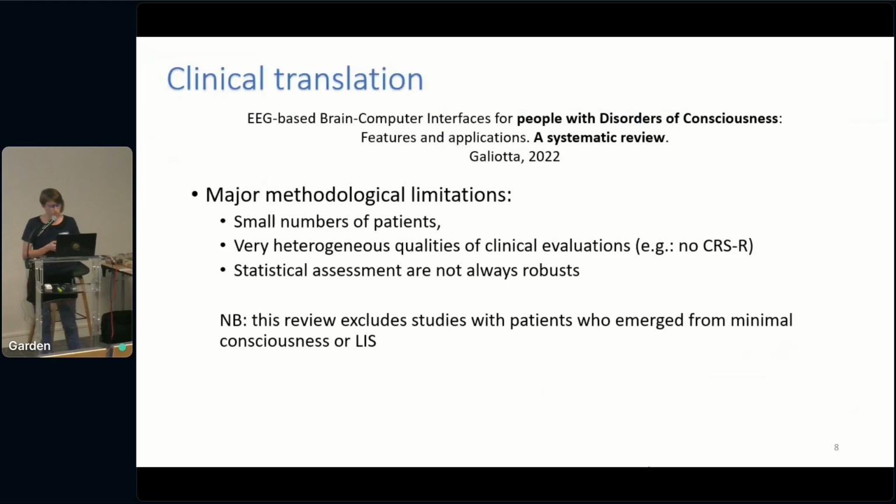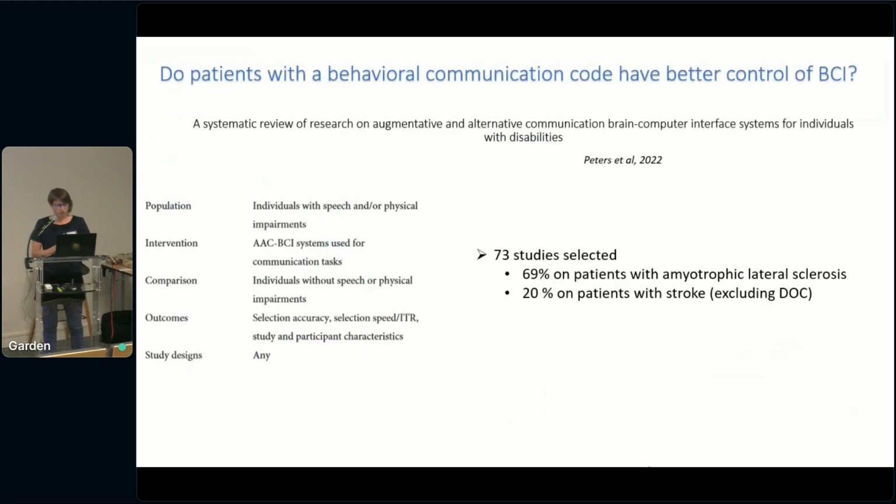Also, this review emphasized that there are major methodological limitations in these studies: very small numbers of patients, very heterogeneous quality of clinical evaluation, and the statistical assessment is not always very robust. And this review excludes studies with patients who emerge from minimal consciousness or locked-in syndrome. So we do not know from this review if it's efficient for them or not, which would be important to know. So is it easier to control a brain-computer interface when you're conscious?